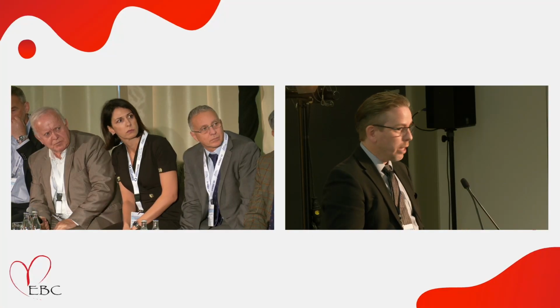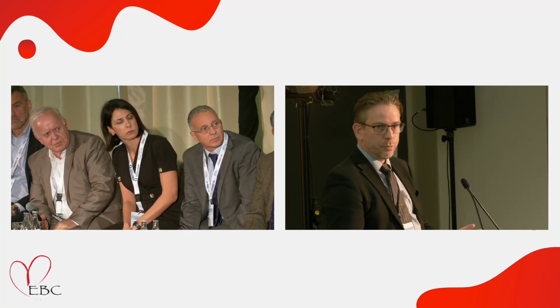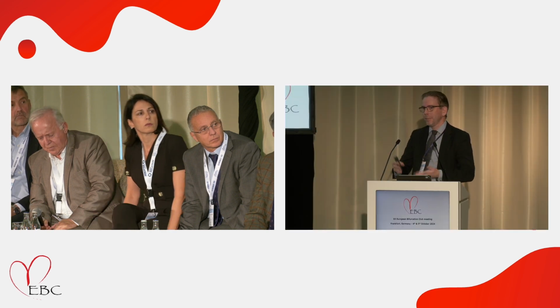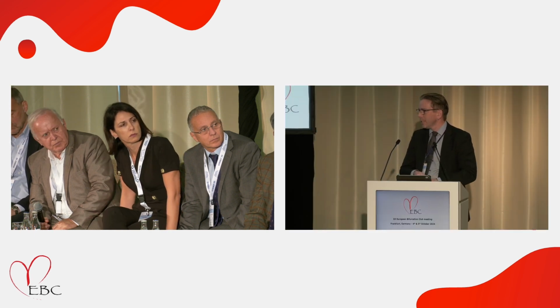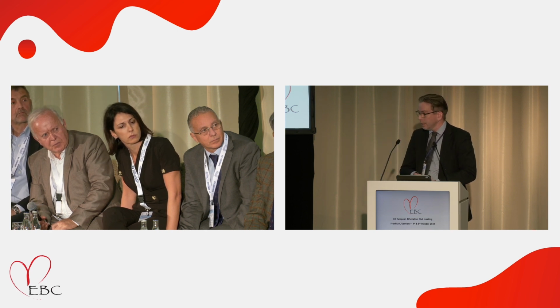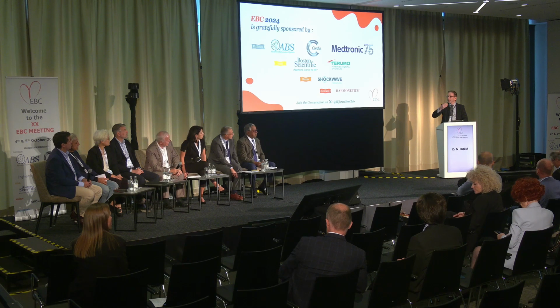Yes, so I think that's a very important finding because it highlights what we have discussed previously in this meeting, that training is extremely important. We should also notice that we had absolutely expert operators in the trial, but we also had some with limited experience with OCT. So we had a broader mix than has been communicated in some meetings. So we did have some that were on the learning curve. But even for experienced operators, this can be difficult sometimes to identify, and it requires that you systematically follow the wire out of the stent.